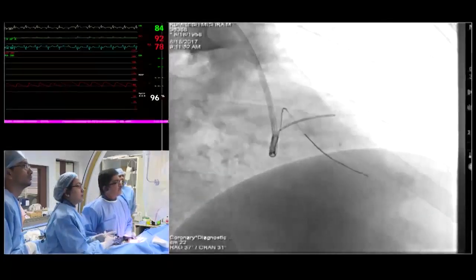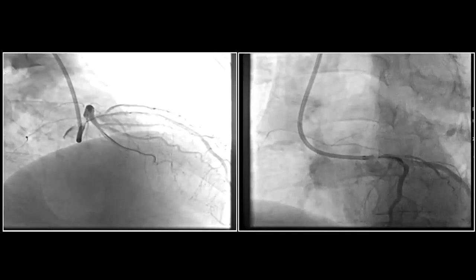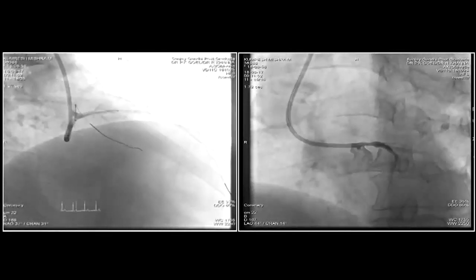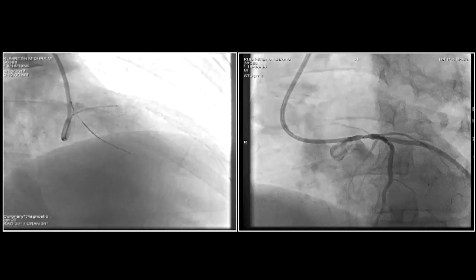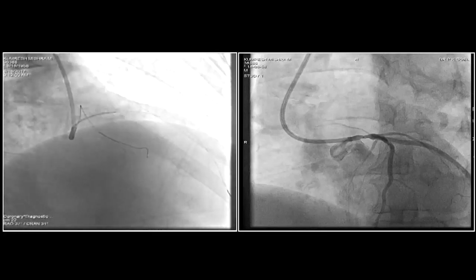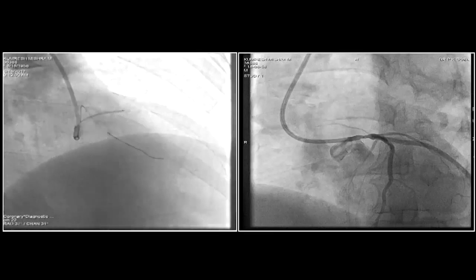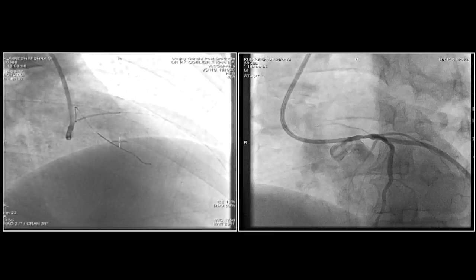Angio biplane, please. A little proximal, sir. I have to pull it back. So now this placement is a little important, because my guide is also sitting there. Some of these challenges here are, as you pull the stent back, you suck the guide in. Now you see the LAO cranial.